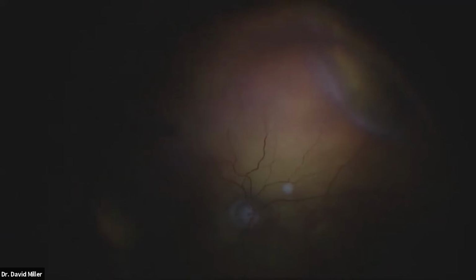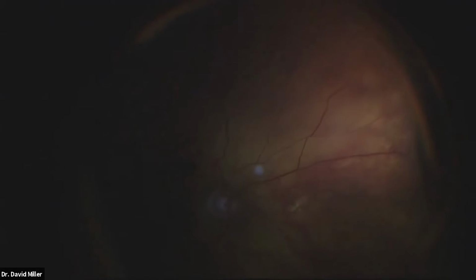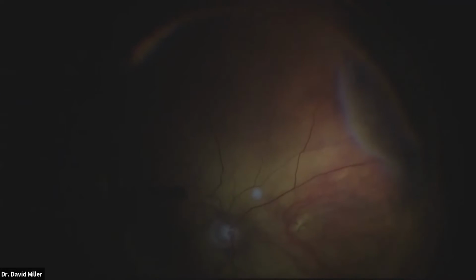Right. So I tend to run the cutter speeds pretty high when we're shaving and turn the aspiration down to low flow mode. Actually, I use flow more than aspiration. So cutter speed is what, Mike? 7,000. And it's a dual cutting vitrector, so it's probably higher than that, by how the machine's engineered. And we're flowing at 15 cc's per minute during the normal case, and I go down to 7 when we're shaving.